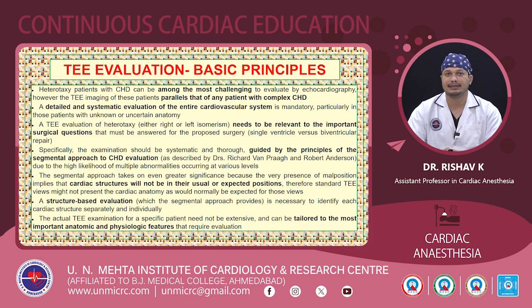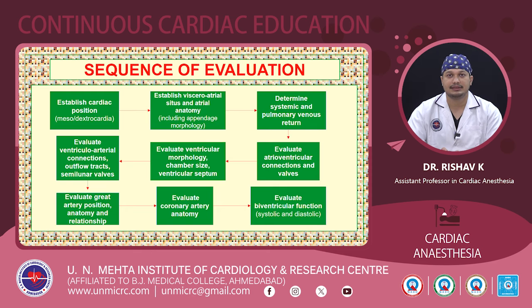So it is a structure-based evaluation, and it is necessary to identify each cardiac structure separately and individually in terms of cardiac segments. This is even more important because the cardiac structures will not be in the usual or expected positions, and therefore standard TE views might not present the cardiac anatomy as would be normally expected for these views. However, the actual TE examination need not be extensive and can be tailored to the most important anatomic and physiologic features that require evaluation. Now, this is in short how we perform a sequential segmental evaluation of any patient with congenital heart disease, and even more importantly for patients having heterotaxy and cardiac malpositions.